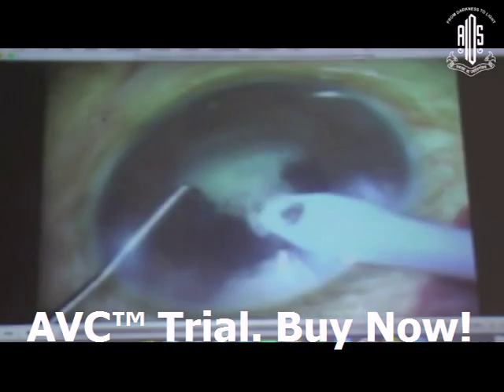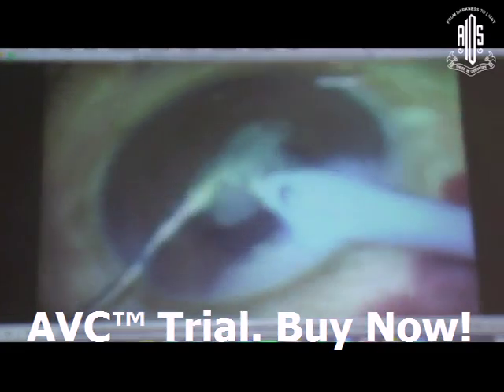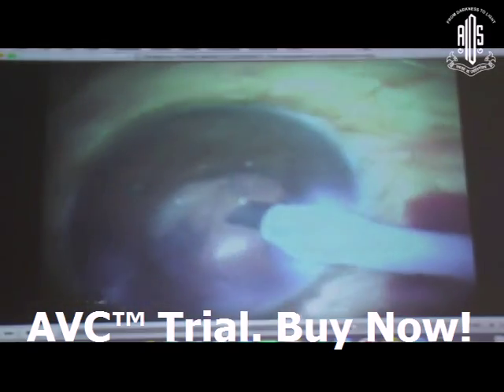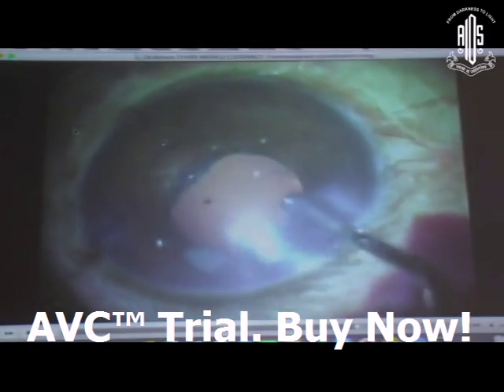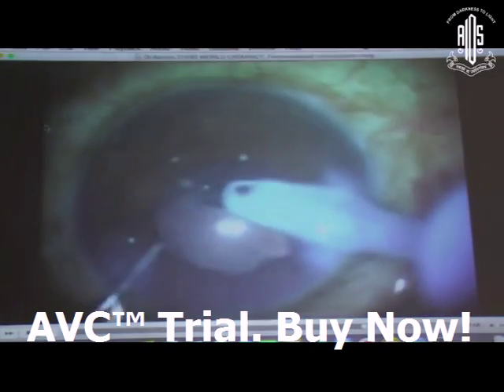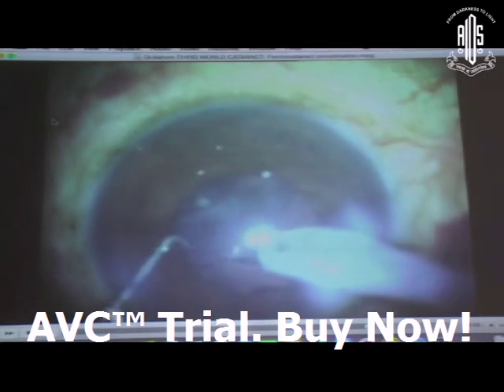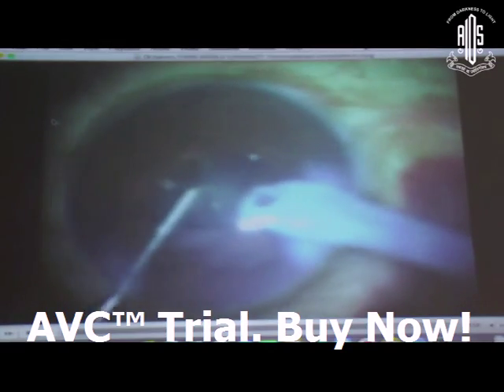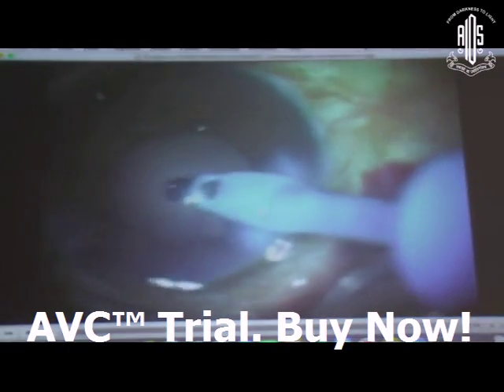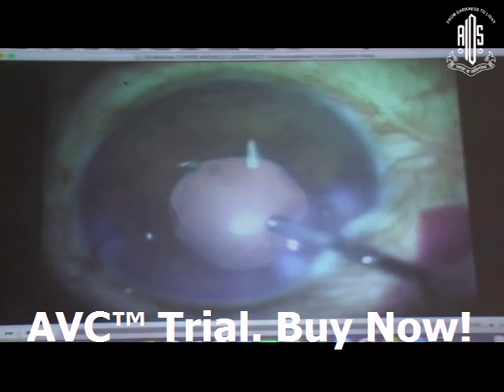But the idea of showing you this particular case is to show you how to complete it manually, even if by chance your femto has failed. So you can see there the cortical aspiration being completed. Then once the cortex has been done, you can always put a lens of choice.